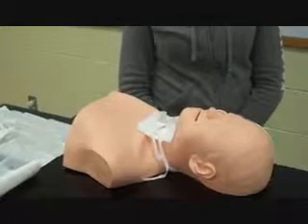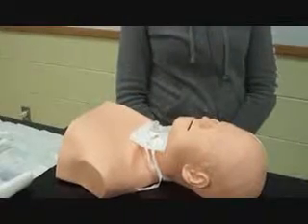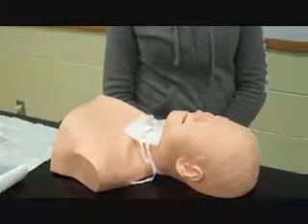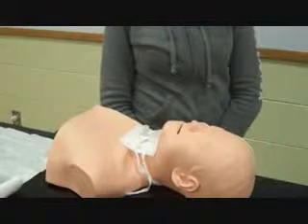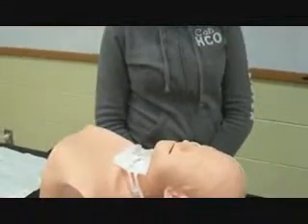Identify 2 different systems that allow trach patients to speak. The electric trach valve and a passive Passy-Muir valve. Describe the purpose of the obturator. The purpose of the obturator is to make the passage of the tracheostomy tube through the trachea less traumatic. And that is it for tracheostomy care today.